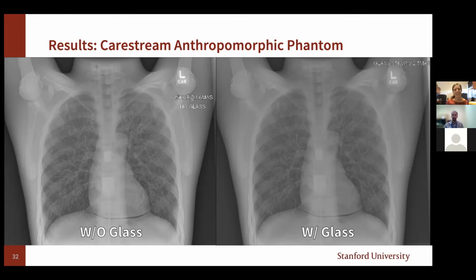I can't answer that definitively, but I would say probably not, because glass is very similar to aluminum, and it's pretty common to use aluminum filters for beam shaping. So I don't think it's anything significant. I think this comes down to the physics of electromagnetic radiation, where our wavelength is way too short. The index of refraction is relevant for optical photons, but once you get into the keVs for photons, the permittivity of the beam and the index of refraction become moot because now you're ionizing. Whoever asked that, that's a good PhD prelim type question. That's a good physics question.